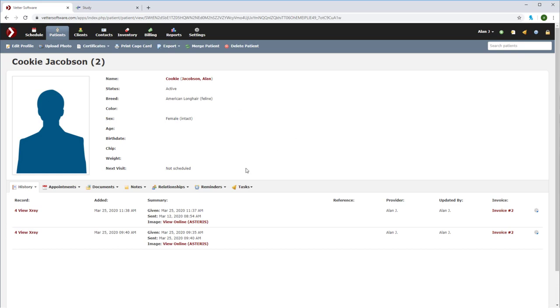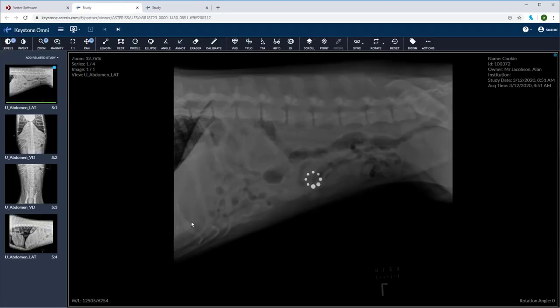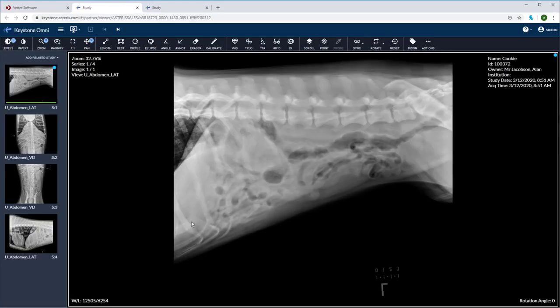And a quick reminder, you can launch the Keystone Omni viewer directly from Vetter by clicking View Online (Asteris). Well, this is going to conclude our training session on the Vetter-Keystone integration. Stay tuned for more videos to come!